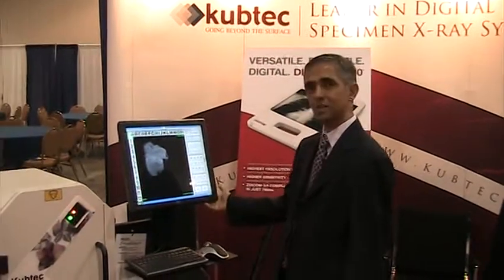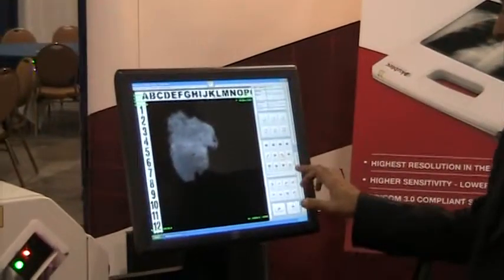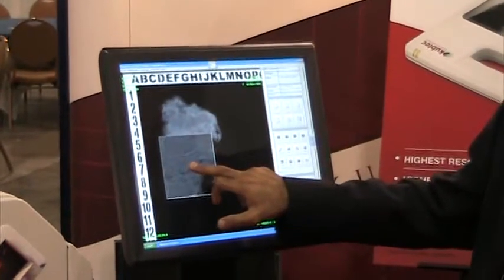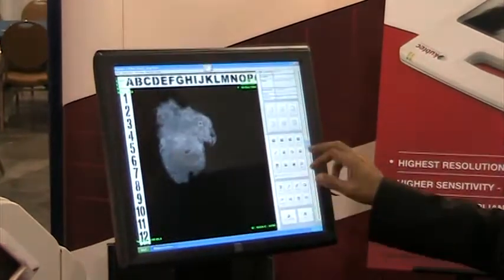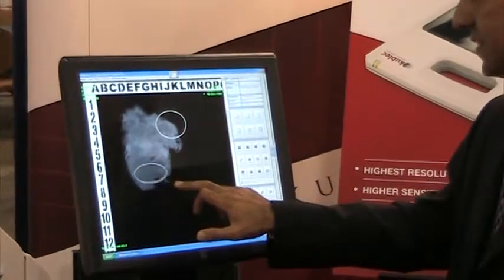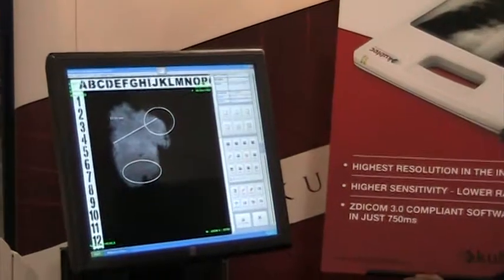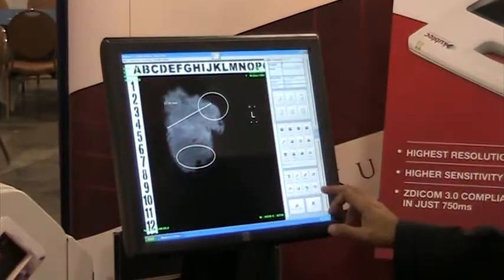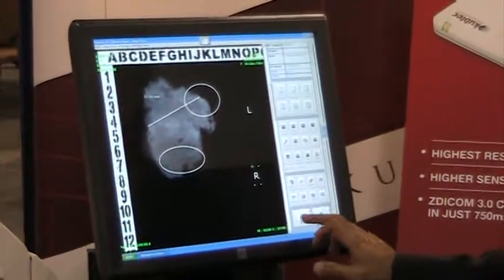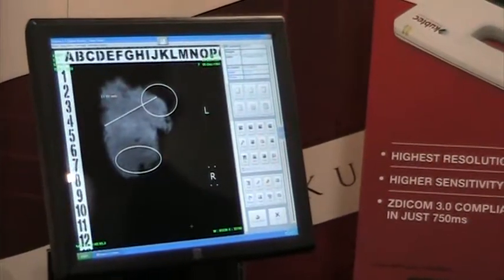Just to show you some of the features of the Expert 40: our systems are designed with the user in mind, whether it is an RT, a radiologist, or a surgeon. As you can see, they come with a touchscreen interface and they're very easy to use. A surgeon could go in and measure their margins, a tech could go in and annotate the specimen, and all the information can be sent to PACS with a single click. You can use the touchscreen interface or you could use a mouse.